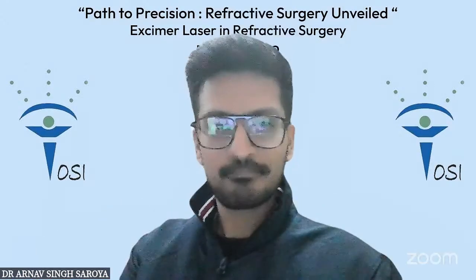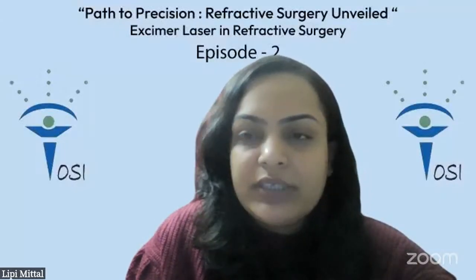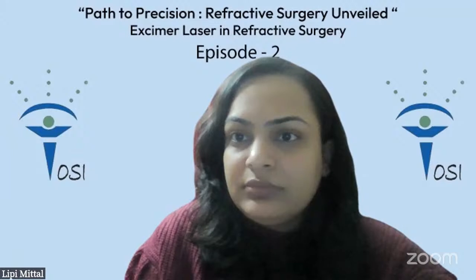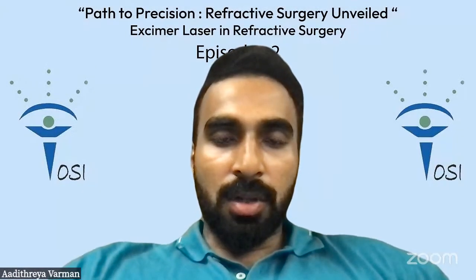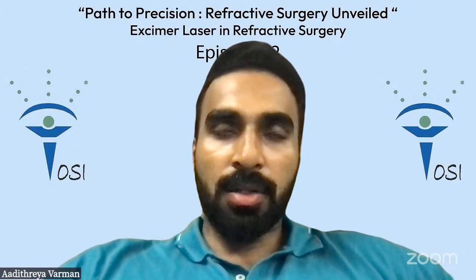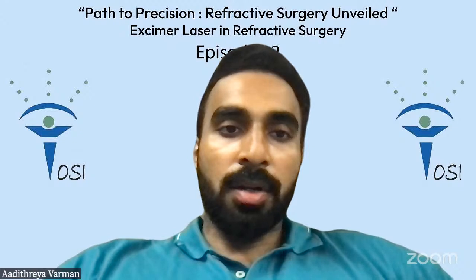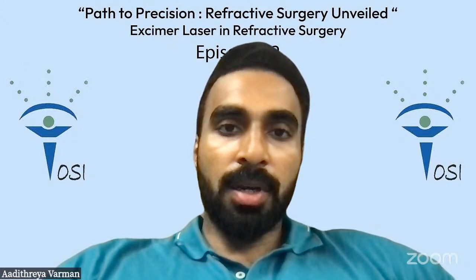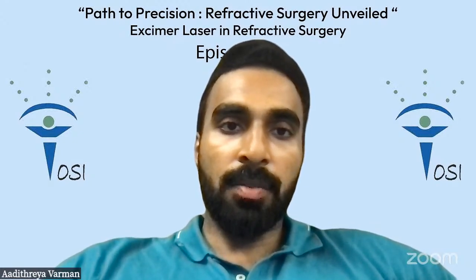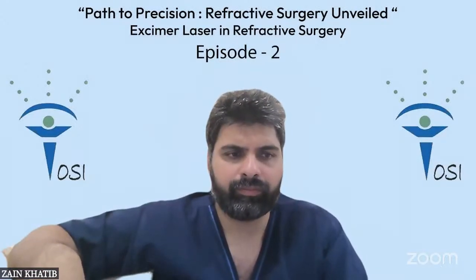All right. Also, sir, what is your choice of procedure for a patient who is 38 or 39 years old? 38, 39, I'll still ask them to undergo smile only. But I tell them that you will need glasses at 42, whenever. Sometimes I do undercorrection. I undercorrect by half a diopter, so they get a little better reading until they're 42 or 43. You can do Presbyopic post smile also.